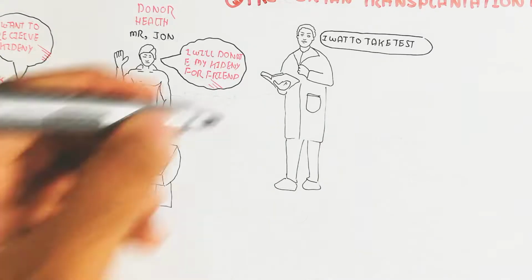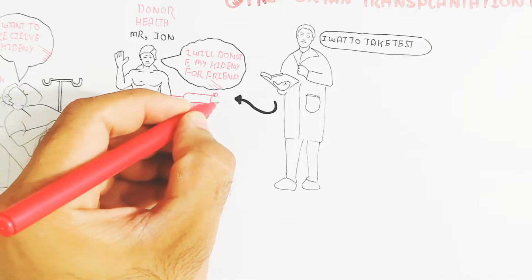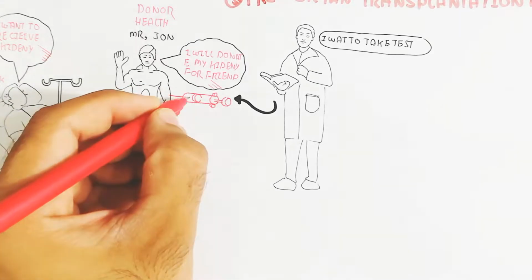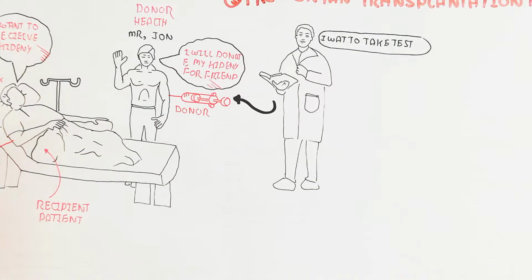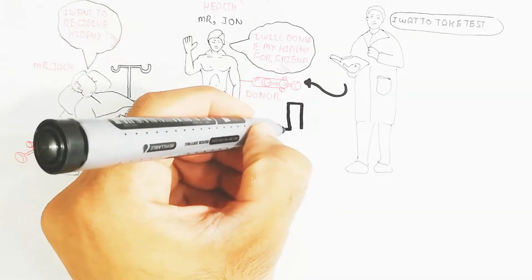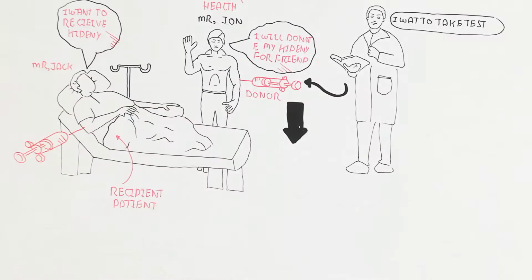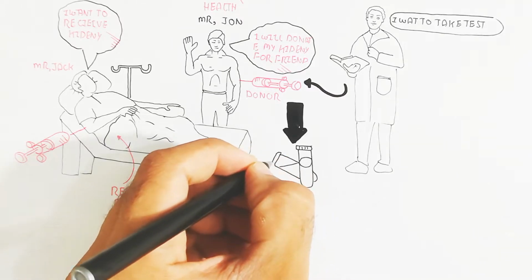This is the doctor, who will check their blood and the blood test for understanding the donation to the recipient as a patient. So how is it possible? It will take a blood sample from both the patient as well as the donor.